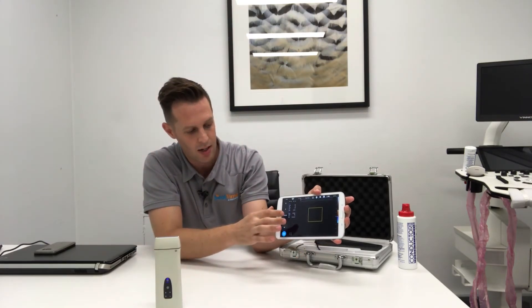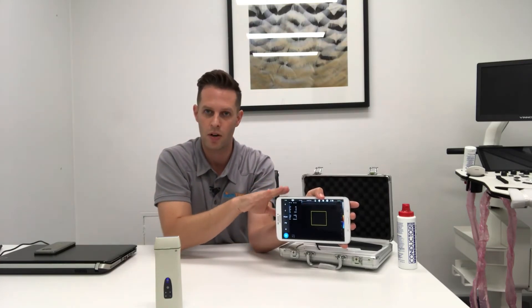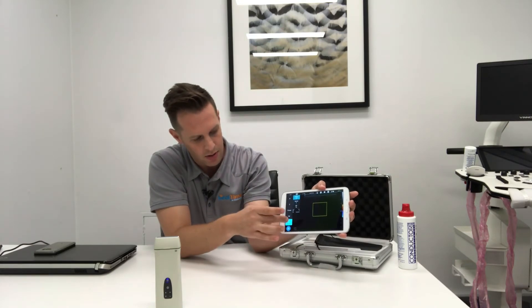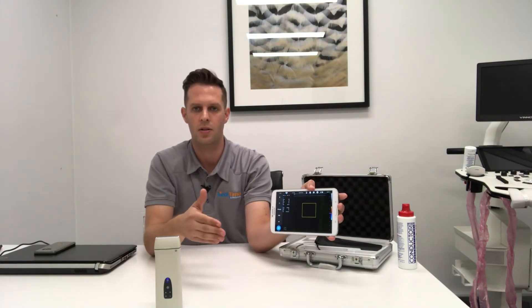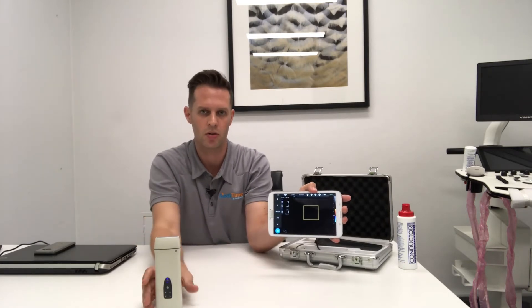You also have power Doppler mode, pulse wave Doppler mode, and you can have the audio for the pulse wave coming out of your device, as well as M mode. So all of the main modes you'd be used to on a standard ultrasound machine are available with the QSono D8.